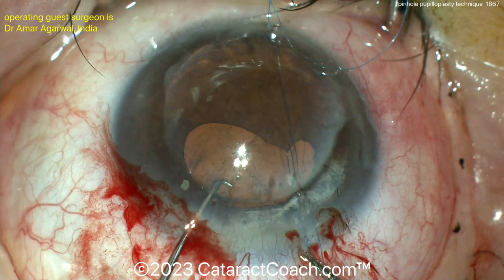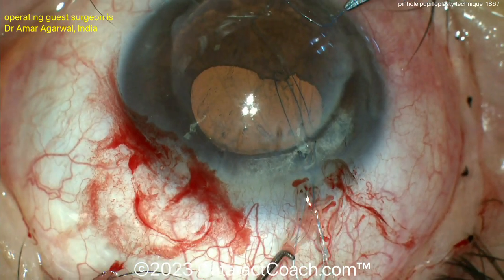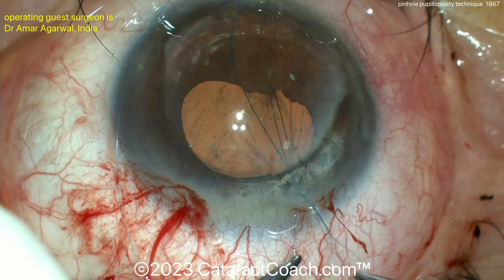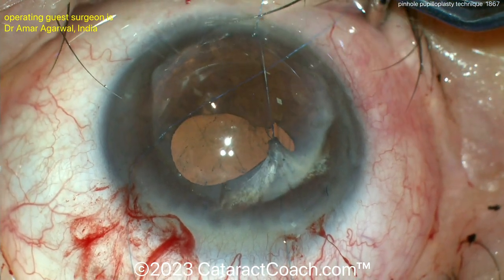The four-throw pupilloplasty means you bring this loop outside the eye and pass the suture in four times — one, two, three, four — and then that can be cinched down. The knot will be brought into the eye and it will hold very securely. There it is, bringing the iris down and you can suture it right like that.